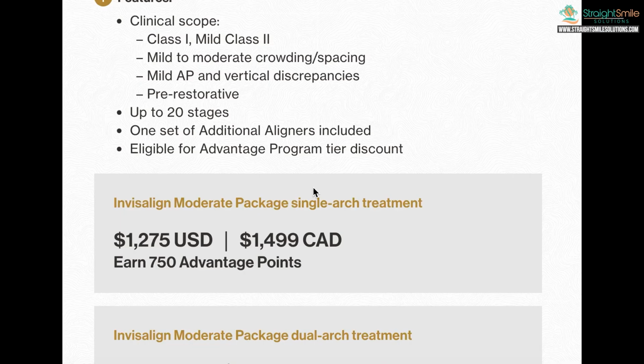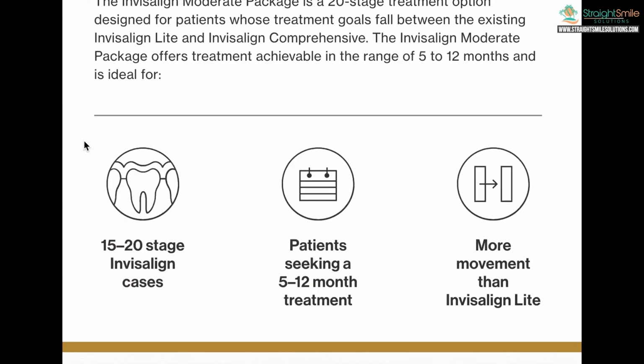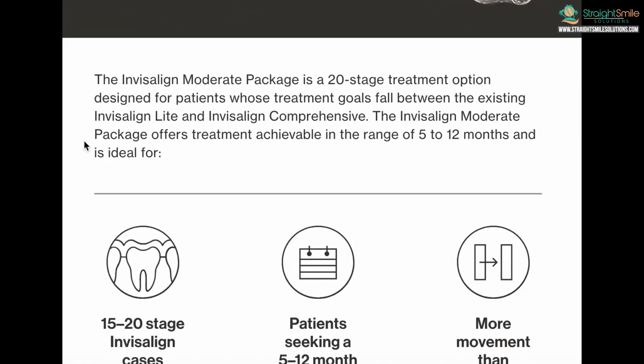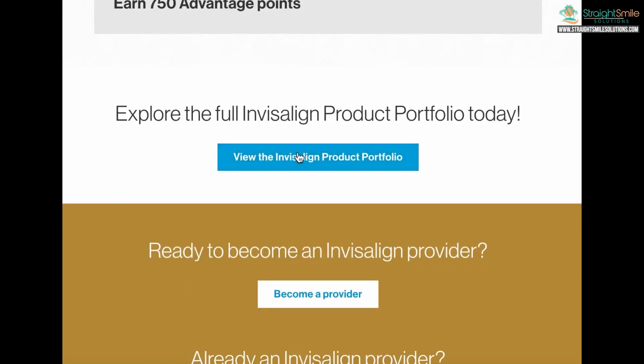Amanda from StraightSmile Solutions, and today I wanted to tell you a little bit about a new Invisalign product that just came up on their portfolio. It's called Invisalign Moderate. I actually welcome this because this is something they actually really needed. So just to let you know the difference between the options out there, I think they've got a nice graph right here. Let me show you.